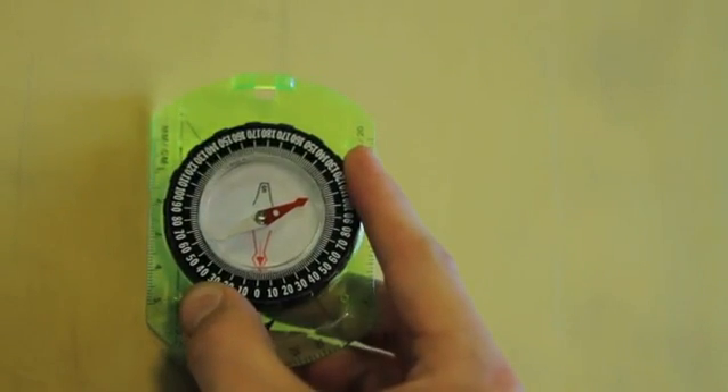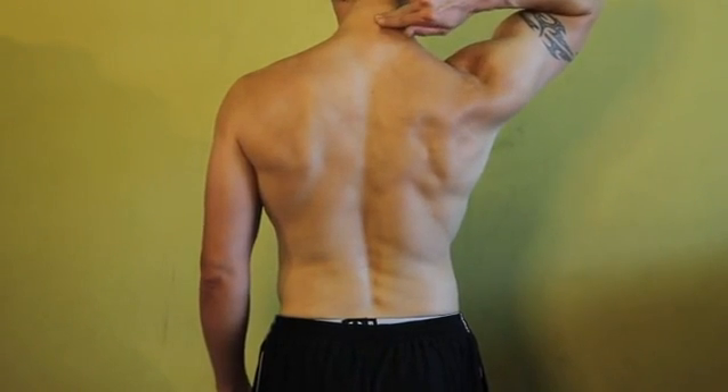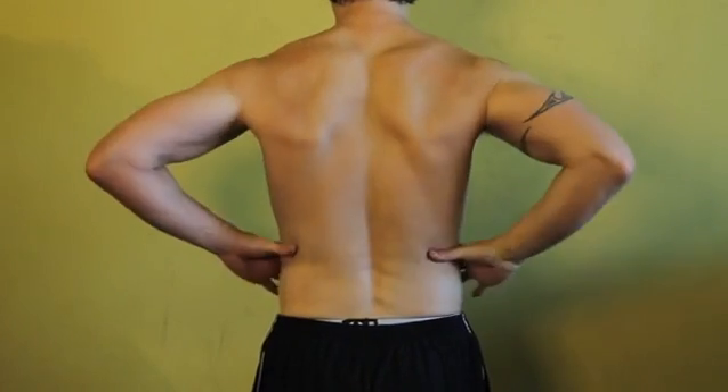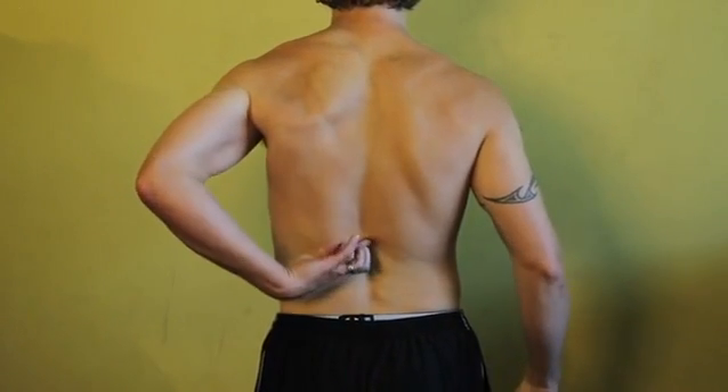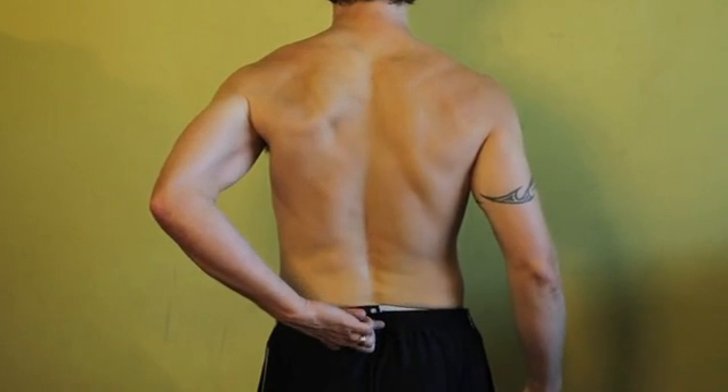To measure thoracic flexibility and flexion, I'm going to put one inclinometer at the C7T1 junction of the spine and my other inclinometer at the T12L1 junction of the spine, and I'm going to have my client bend forward and try to touch their toes. When they get down as far as they can, I'm simply going to subtract the bottom inclinometer number from the top number, and that's going to tell me how much thoracic flexion they have.